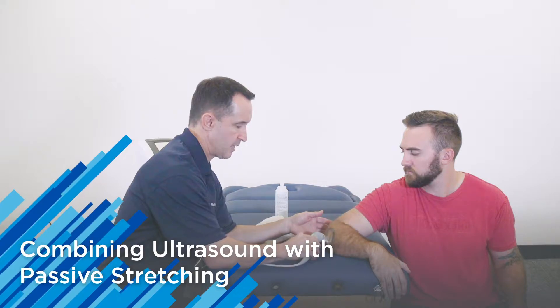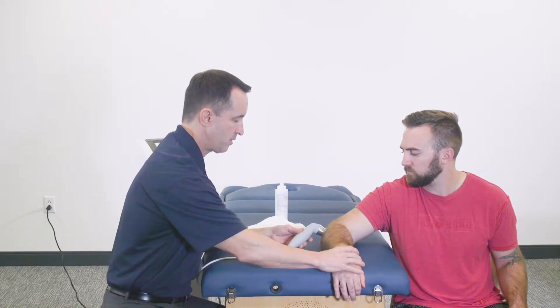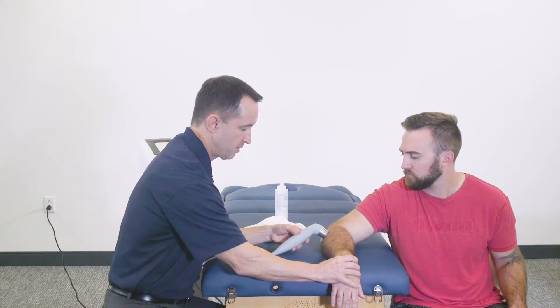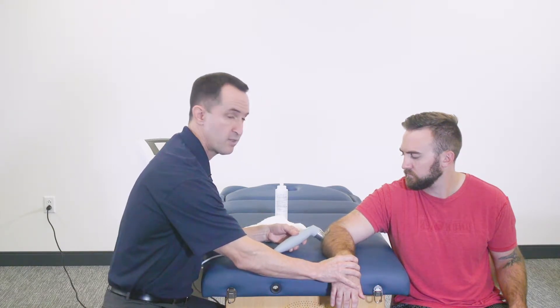As we fast forward to the end of the treatment, I'm going to have the patient extend his wrist over the edge of the treatment table. As I'm sonating that tendon and it's nice and warm, I'm going to apply a little stretch and continue sonating that tendon until the treatment has ended.